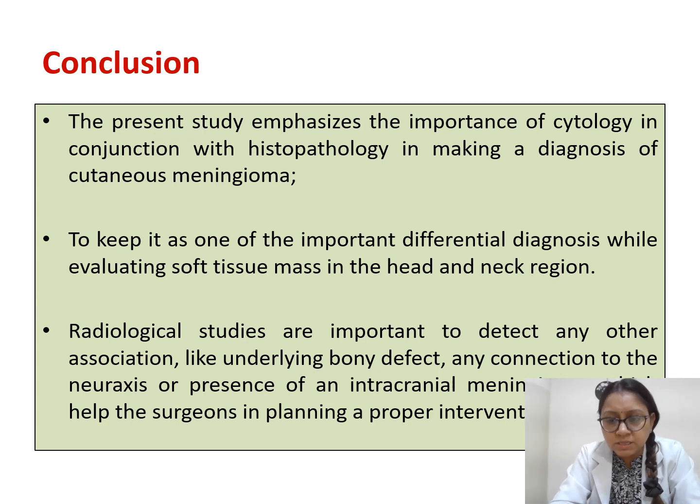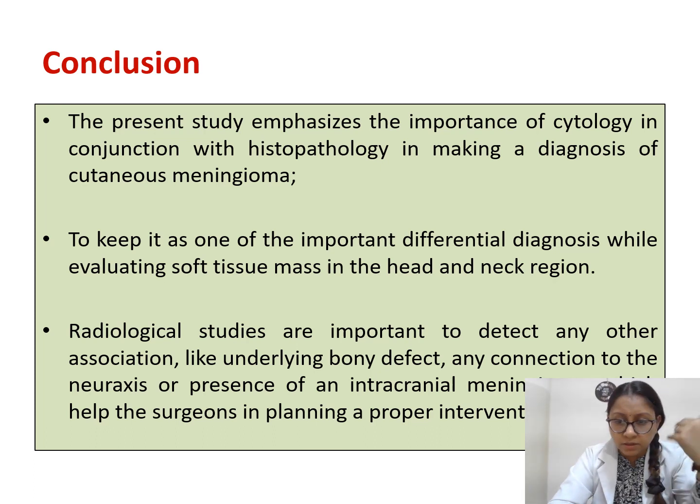So to conclude this case, it emphasizes the importance of a basic test, that is FNAC, in conjunction with histopathology, and the importance of immunohistochemical markers. That is very, very important in labeling any rare tumor. Also, when you are examining a soft tissue lesion in the head and neck region and you get a chance to do the FNA, you have to keep cutaneous meningioma as an important differential diagnosis.